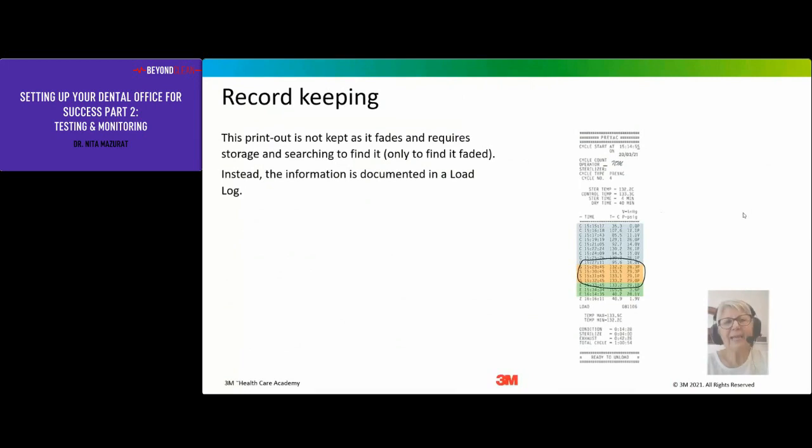Printouts are not kept because they fade, and it requires storage and searching to find them. So instead, that information is documented in the load log, essentially just with a signature that indeed it happened.